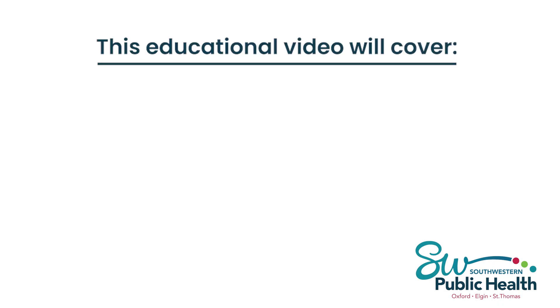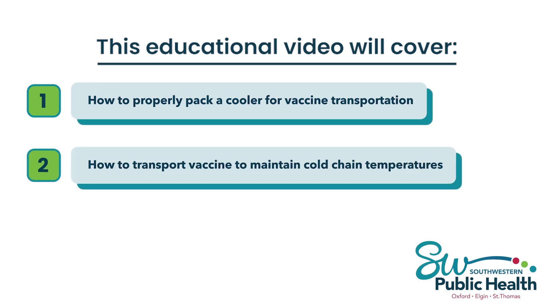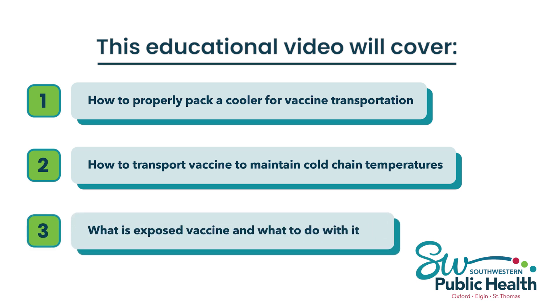This educational video will cover how to properly pack a cooler for vaccine transportation, how to transport vaccine to maintain cold chain temperatures, what is exposed vaccine and what to do with it. Now let's get started.